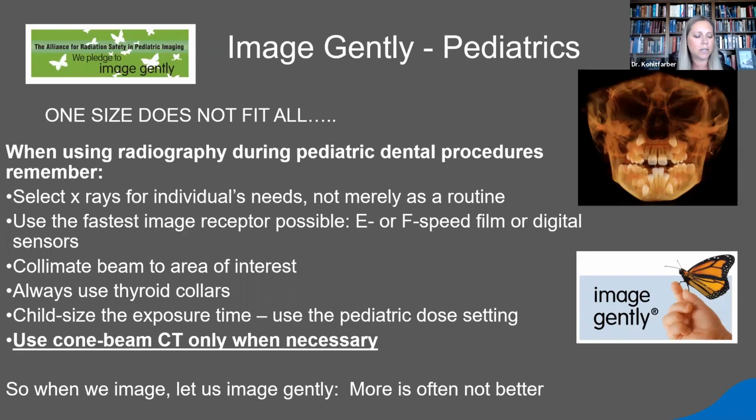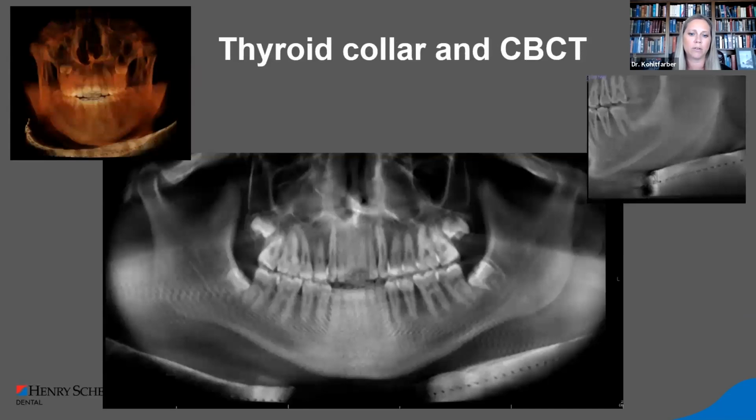And this is really geared toward the medical community. When you think about some of the medical CTs, those are much more dose than our CBCTs. And so they were trying to limit the dose for the children as far as taking ionizing radiation like medical CTs. But like I said, it is coming into dentistry and you may as well be ahead of the curve. So check that one out.